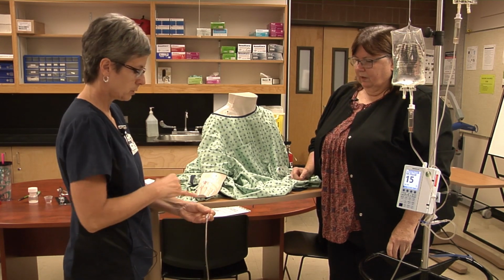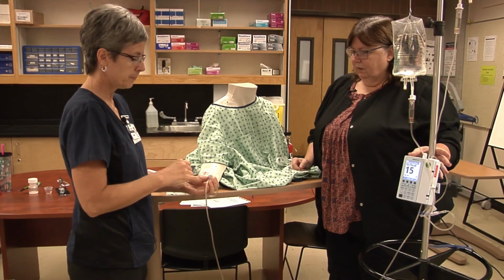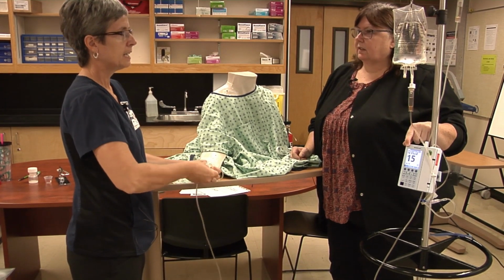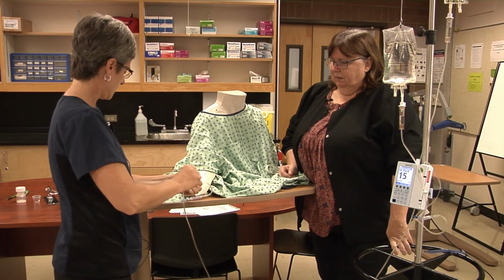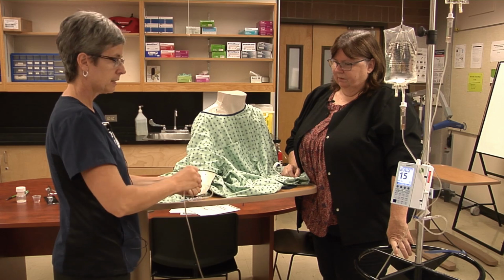You find the port closest to the patient, which is this one this time. Do we have to worry about the rate here? Because this is going pretty slow. Yeah, I'm going to do that in just a sec. Good question.